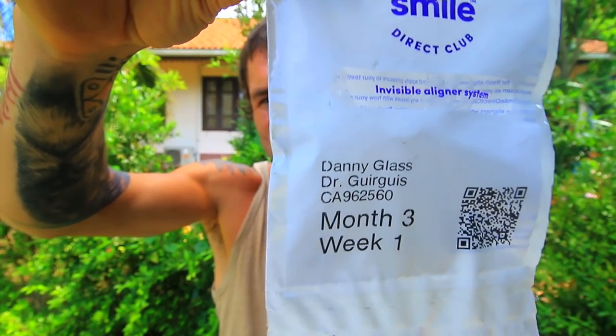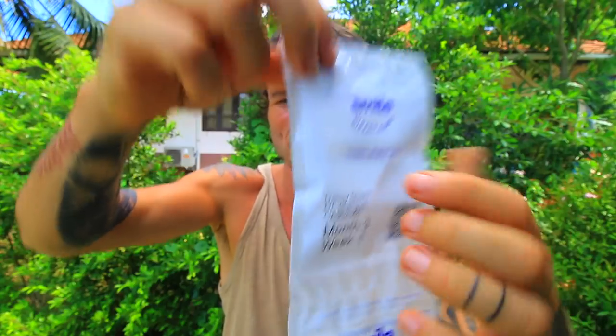You get assigned a specific doctor, dentist, or orthodontist, and they will check how you're getting on around every three months. They'll email you and let you know a few things they need you to do to see how you're progressing. The customer support is really good from this company — they get back to you really really quickly. I absolutely love this company and I've had no issues with these braces or this company whatsoever.